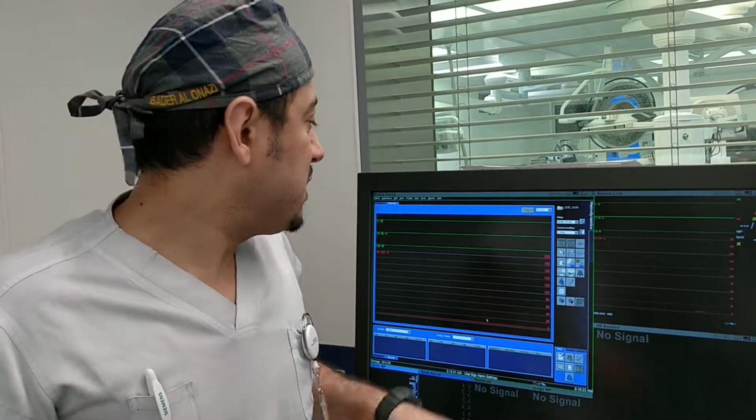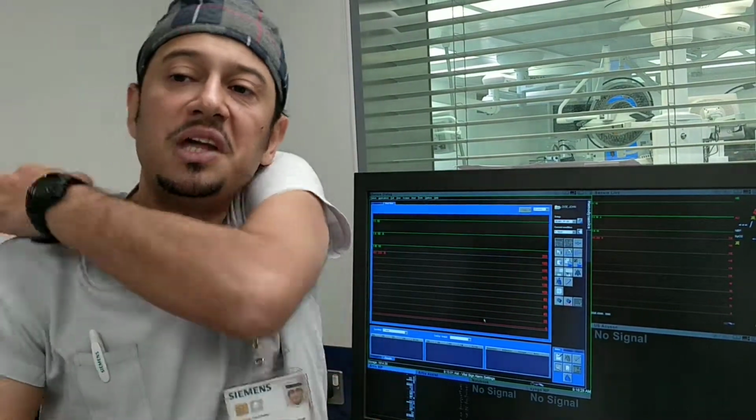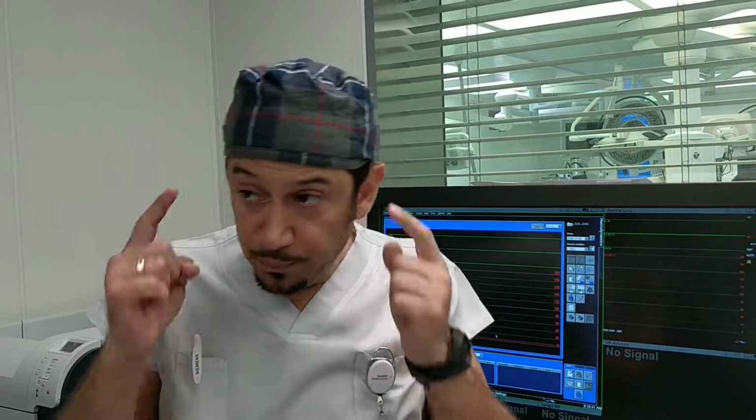Why? Because lead 2 might be attached here. It can be attached here. It can be attached anywhere. So there are dynamic ECG changes, but do not presume that they are related to an area if you misplace your lead. Gotta think, okay? So, Prabhu comes and he puts the lead in the leg. And there's ECG changes. And he says, my changes are anterior. No, doctor, it's just the lead is here. Take it easy, boy, okay?